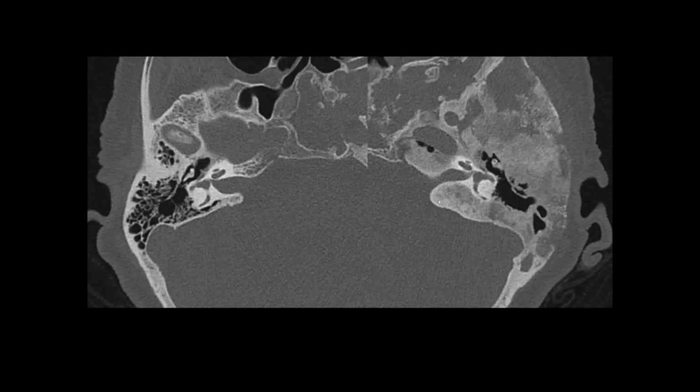And so here you can see this is axial images of the right and left temporal bone. You can see that there's diffuse expansion of that left temporal bone relative to the right. You can see the sparing of the otic capsule, ground glass density, very characteristic for fibrous dysplasia, but this also has a cystic type that's going across involving the clivus here. And then you can even see a little sclerotic type with these little sclerotic hyperdense foci scattered throughout.